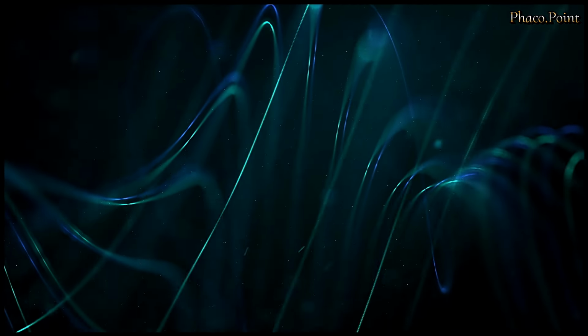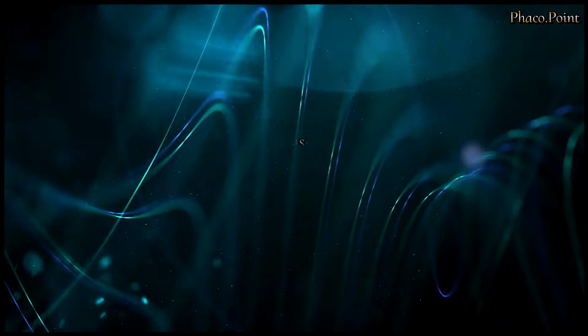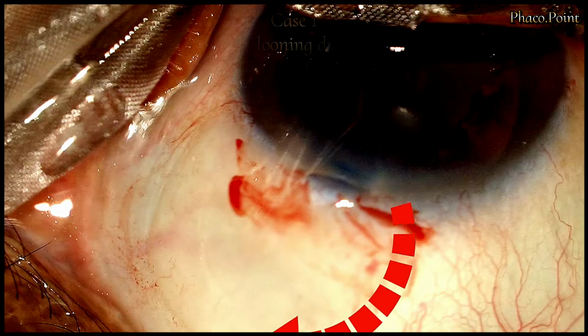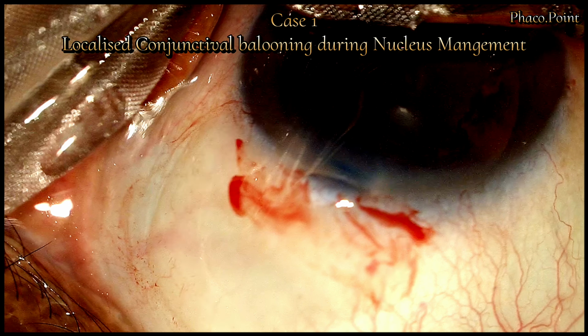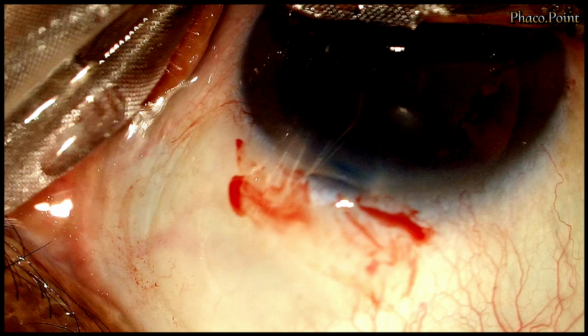Here are two cases discussing the same. Let's move to case 1. Here's a case where there was a localized subconjunctival ballooning which was picked up during the end of nucleus management. Upon looking more closely, you will notice a breach in the conjunctiva at the area of the main incision. And therefore, you'll now be able to understand how the backflow of fluid from the phacoprobe has found its way through the breach in the conjunctiva at the area of the main incision into the subconjunctival space. Now let's see how this is surgically managed.